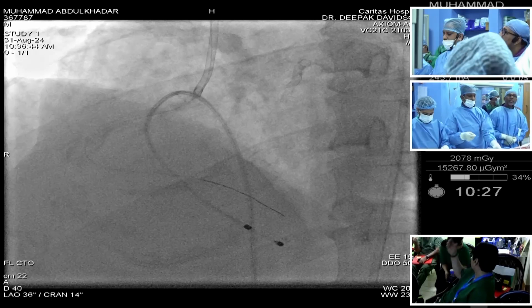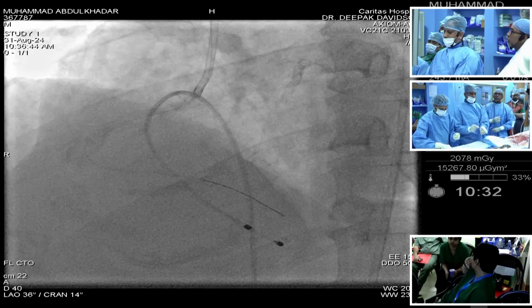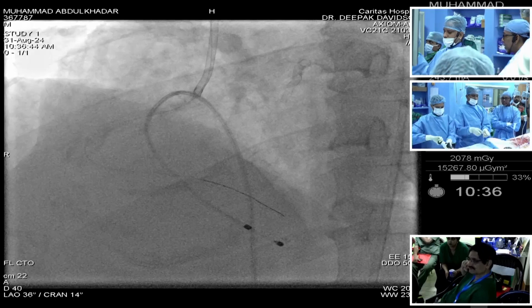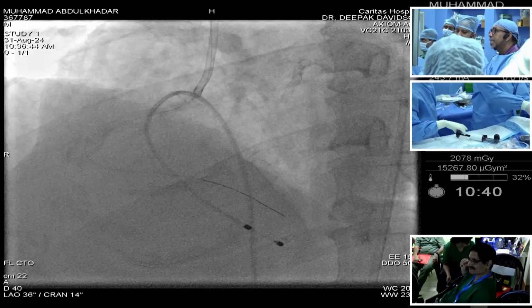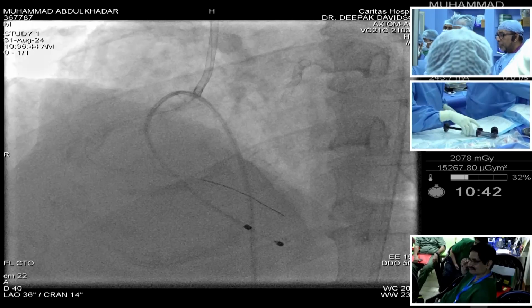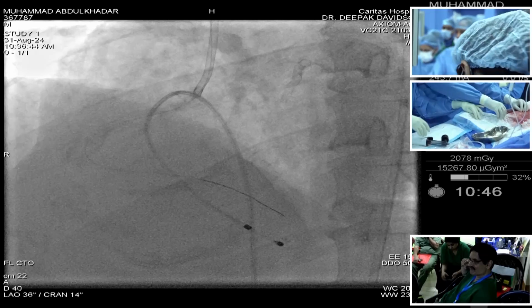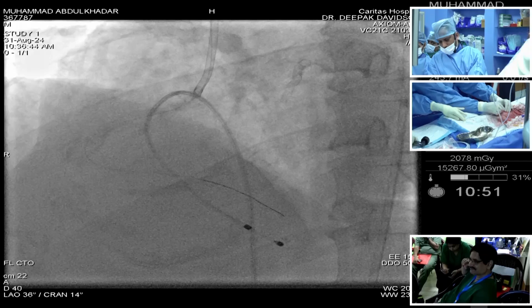So as somebody was asking there, are you happy with whatever you have done? Now you could always go in for more. It's proved with bench testing that here we saw that we just did 3 or 4 times of burring, but as you keep increasing it up to 10 times, you get more and more of luminal gain. That is what the data says. That's what the bench study says.